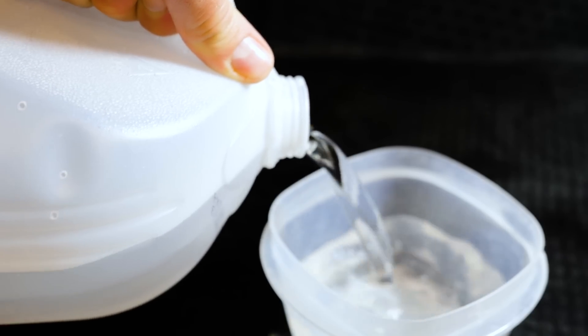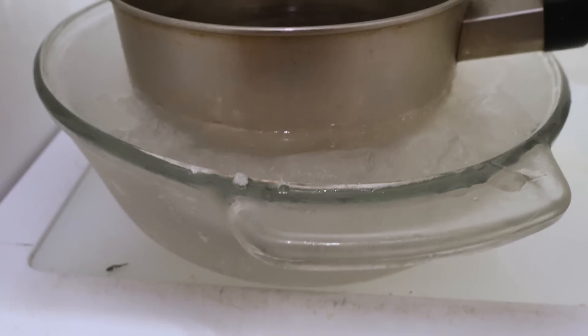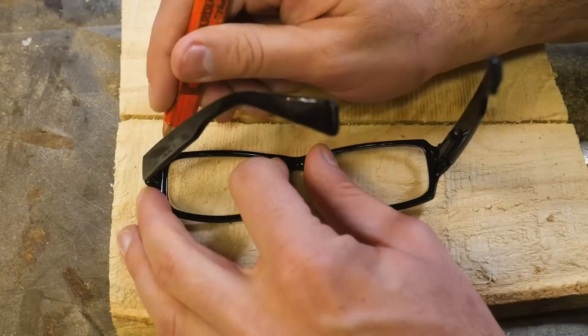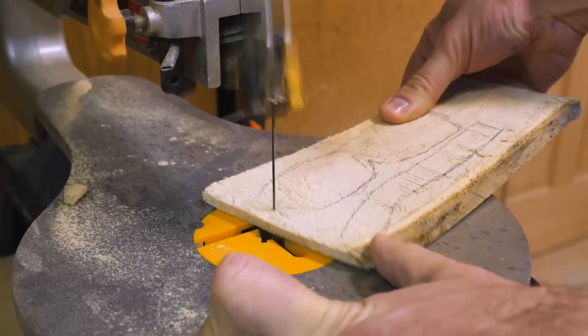For making clear ice, I'm going to attempt a variety of different methods: using distilled water so there are no impurities, boiling it multiple times to remove any air bubbles, various shapes and molds, and a couple of techniques to make it freeze in a specific direction. While I let those freeze, I also wanted to try a different type of vision correction that a few people mentioned in the comments: pinhole glasses.